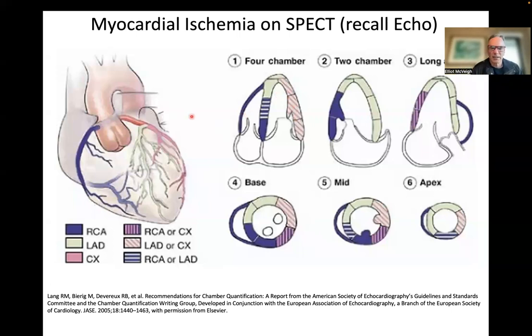I think we did this in one of the early lectures, where we look at the standard coordinates that images of cardiac perfusion are given. And remember, you look at on the donut, these are called the short axis. They're cuts this way through the heart, slices this way. And we're looking from the apex of the heart up towards the base of the heart, or the feet of the patient up towards their head.